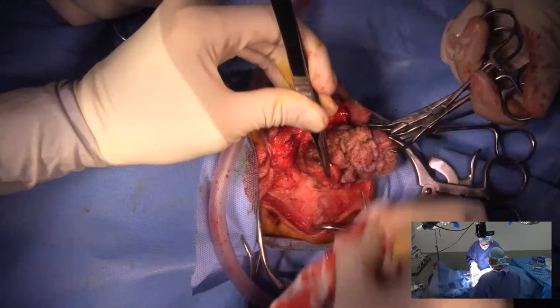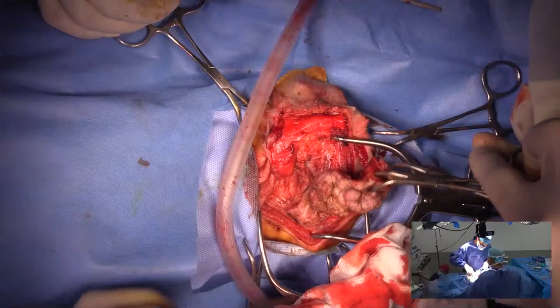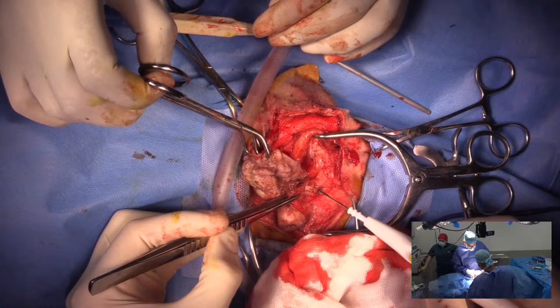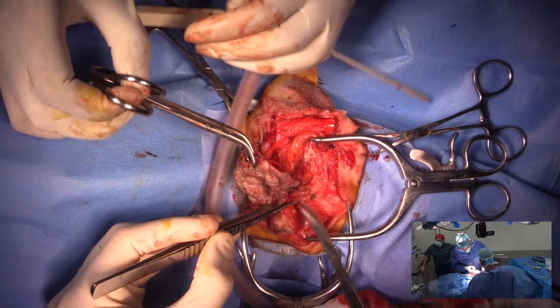I'm cutting through parotid salivary gland here, which doesn't cause any problem. And I can see twitching down here, so it means that I'm getting probably closer to the facial nerve. And I would not attempt this without an assistant. So now I'm being really careful, trying to dissect down onto the auricular cartilage.